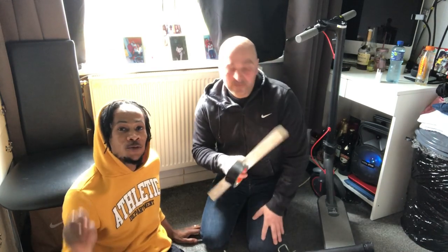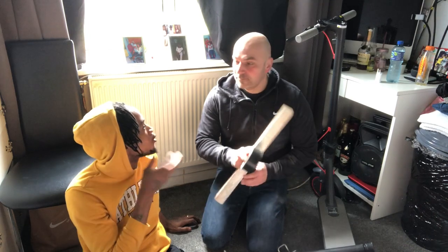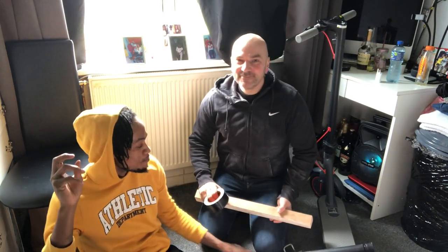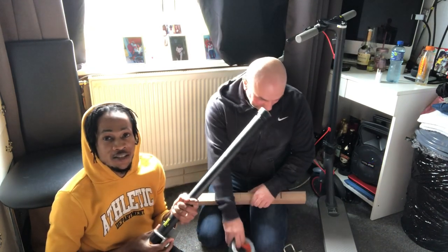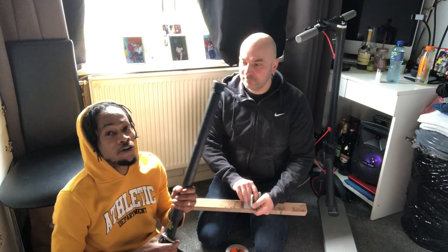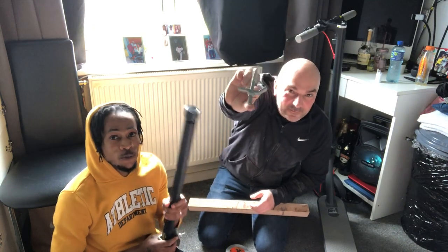Alright guys, welcome back guys, we are back with another video. So today we are here with Mr. Jumbo. So guys, me and Jumbo are going to install the scooter to the wheelchair guys — everybody has been waiting for this video. Jumbo came up with a great idea, so today we are going to show you how we are going to do it.